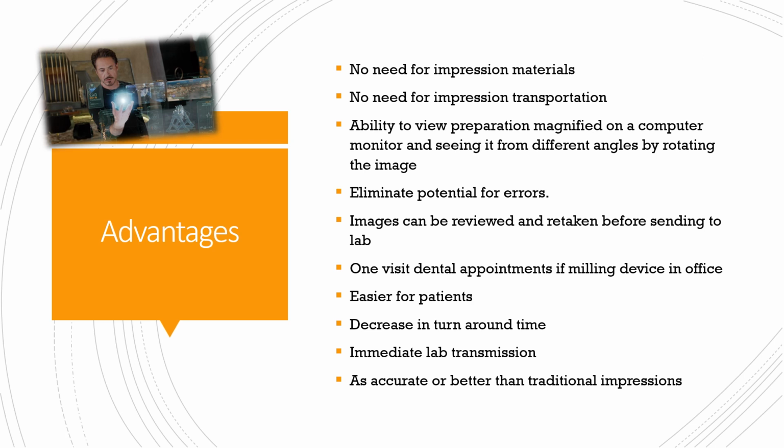And with that erase tool, it allows you to correct that image. If there is a flaw or a void or something there, it allows you to immediately view it, correct it, so then you can send it to the lab, which helps eliminate the potential for errors. Images can be reviewed and retaken before sending them to the lab.